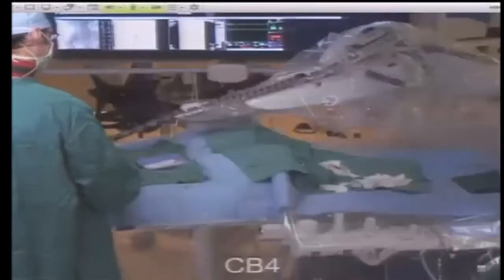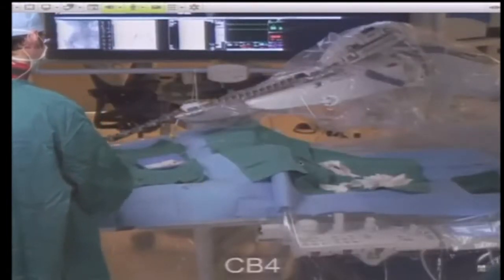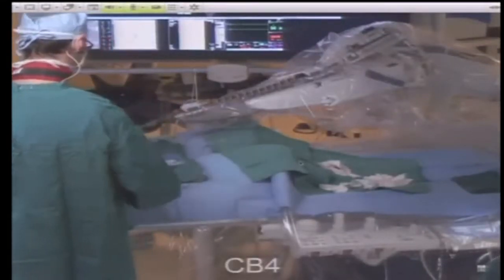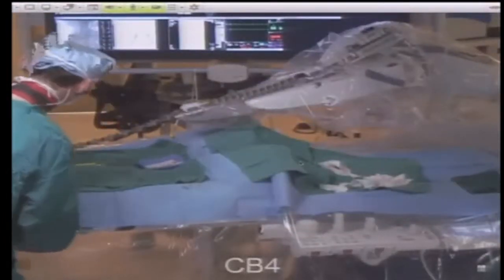Because these are long catheters, you need some control in terms of buckling. So there is this large accordion-like device called the anti-buckling device — pretty self-explanatory — and that permits a smoother glide transition into the artery, into the sheath that is right here in the groin.